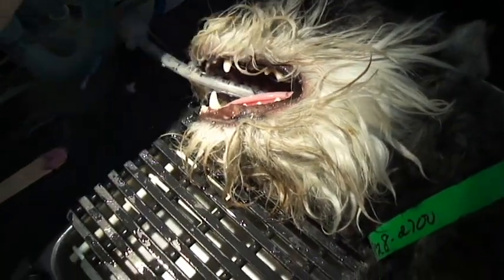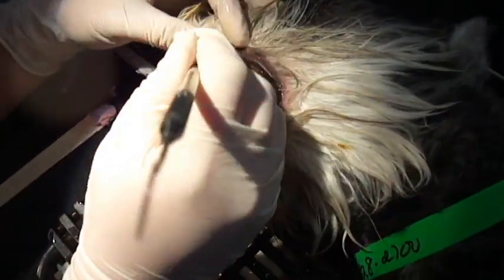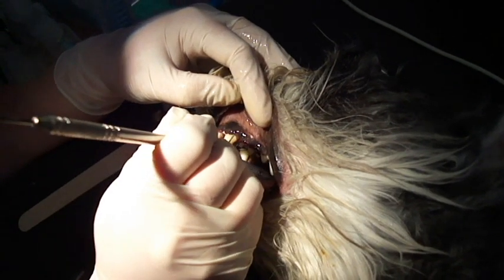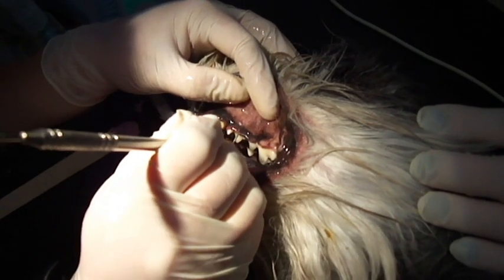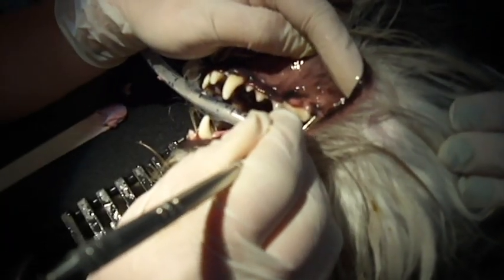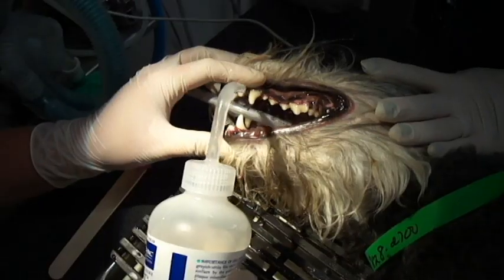Okay, we go ahead and probe for pockets now. We're going to probe for periodontal pockets, because what happens is food and bacteria collect in those pockets and they could lose a tooth. But we have a product we can apply to those pockets that seals off the pocket.